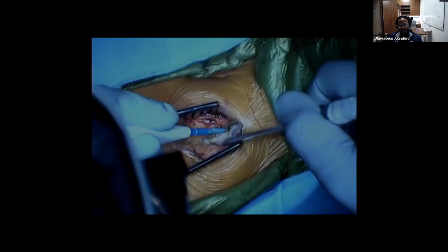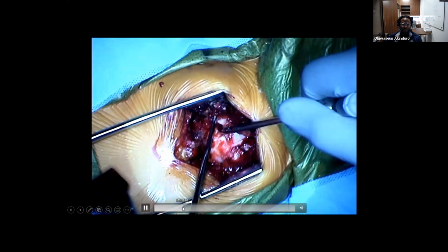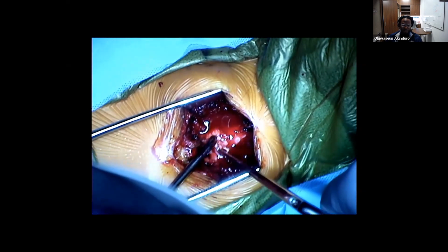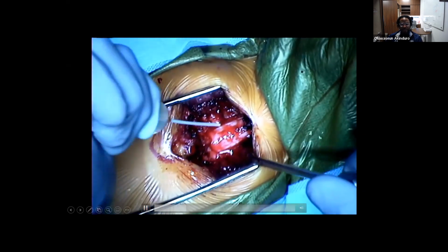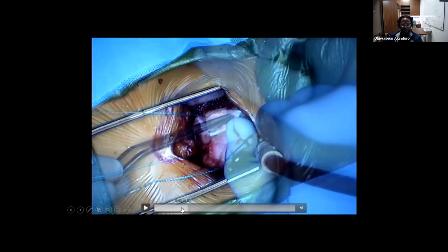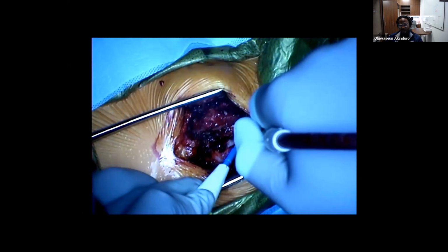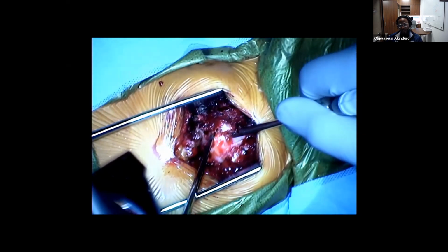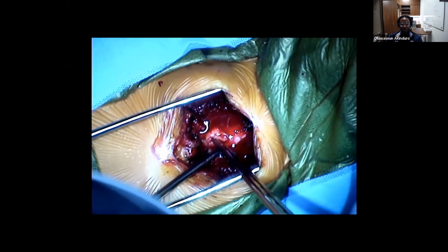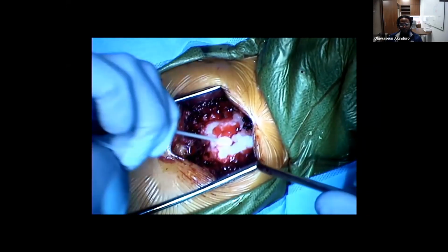And then, like you said, we continued with our laminectomy, and we did not place the screws. So what we did is we drilled the hole for the screw, and then we tapped the screw hole, and then we left the screws out just so that they wouldn't be in the way while we're doing our tumor resection. And then, as mentioned, we took a decent amount of the facet joint off to the left, to make sure we had a slightly more lateral trajectory, so we could retract the dura enough to try to avoid inadvertently hurting the spinal cord.